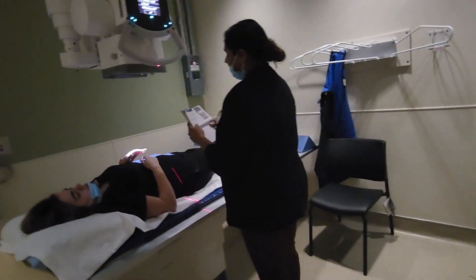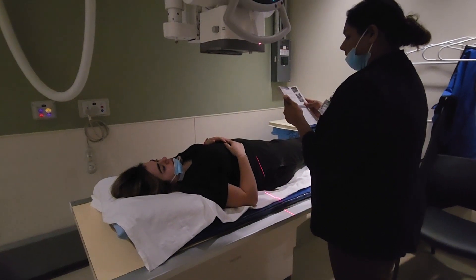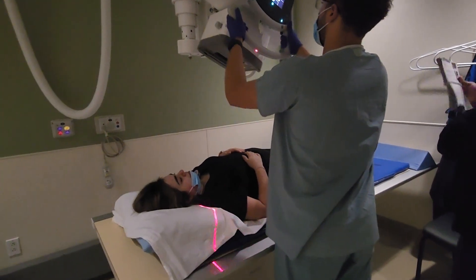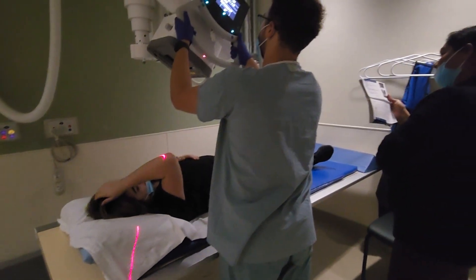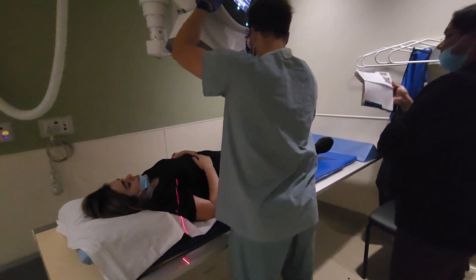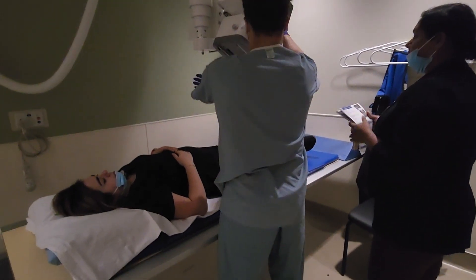SI joints — located between the sacrum and our iliac crest, sacral iliac. For these, there is a 30-degree cephalic angle and our center point is going to be one and a half inches above our pubic symphysis. That's basically two inches below the ASIS — so one and a half inches above our pubic symphysis is the same thing as two inches below the ASIS.